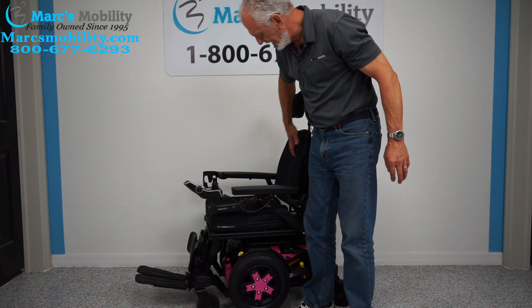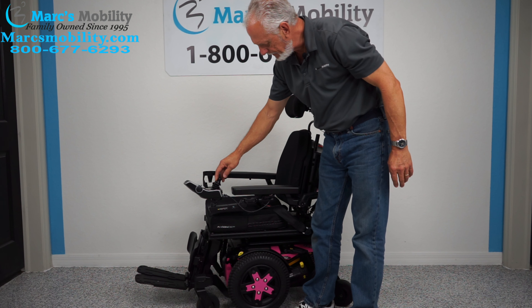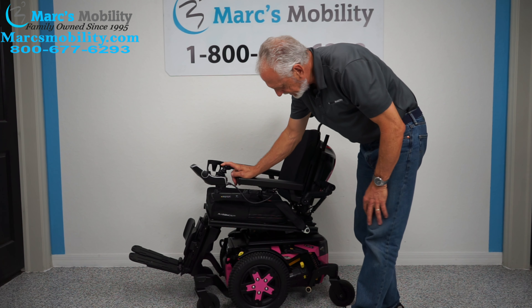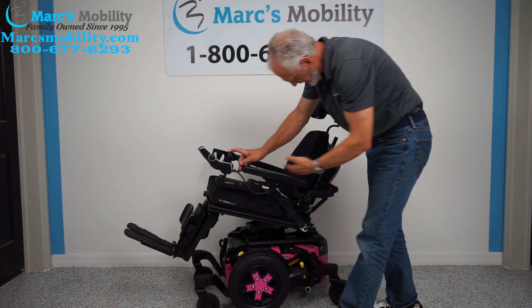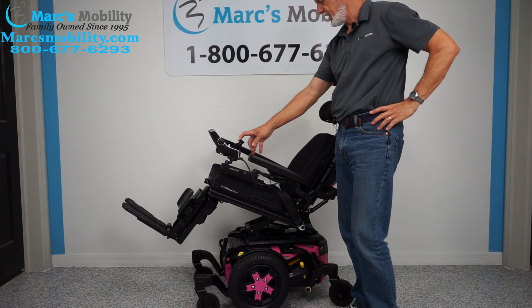Right now the yellow is on the back and on the bottom — that would be your tilt. If I start pushing this back, that's the electric tilt. The tilt is when your bottom goes back, and of course it takes the legs and back because they're all connected together.